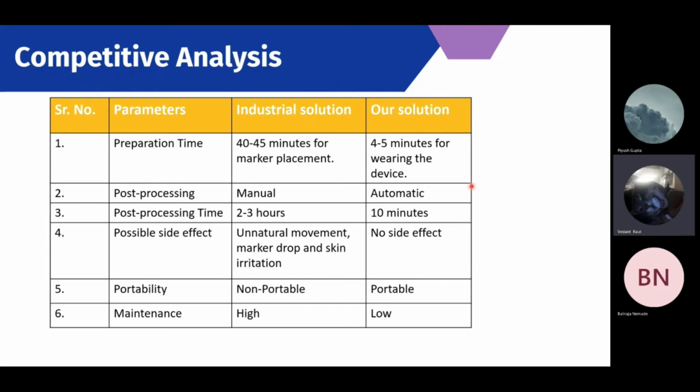And coming to post processing, mocap systems require a technician to operate the machine for post processing, whereas our solution does that automatically. And coming to the post processing time, the industrial solution requires around 2 to 3 hours, whereas our solution does a similar analysis in 10 minutes.